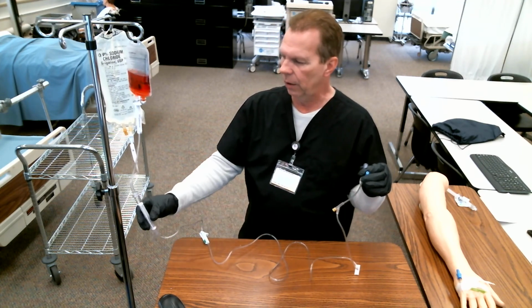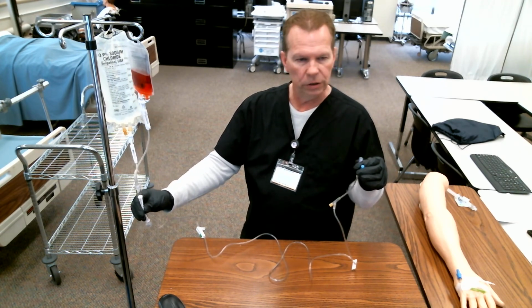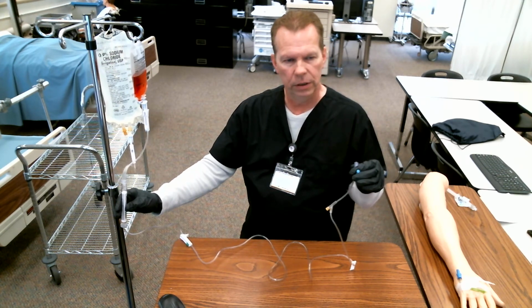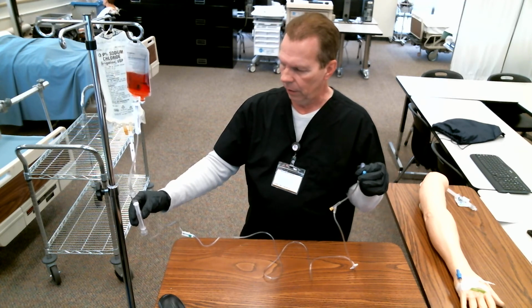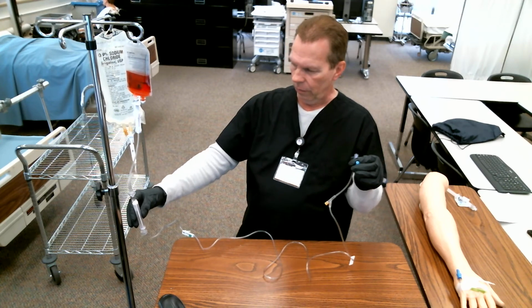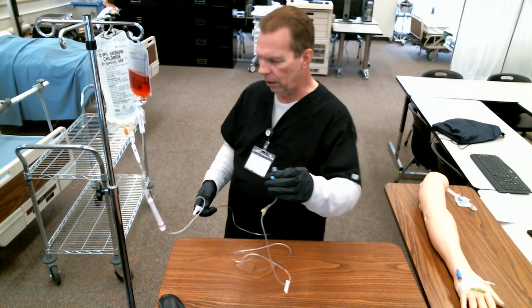So what I'm going to do is squeeze my drip chamber and start pulling solution, and you can see the solution there getting pulled down in there. And I'm going to keep squeezing my drip chamber until I get solution over the top of my filter, and that looks like that's a good deal right there.